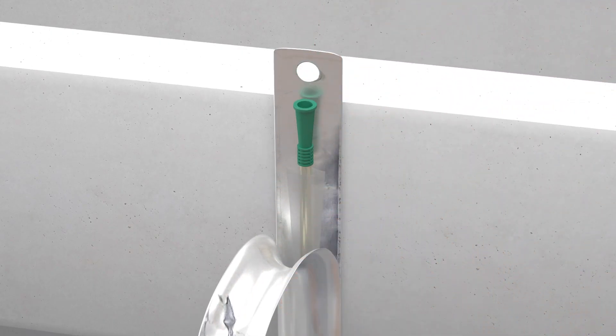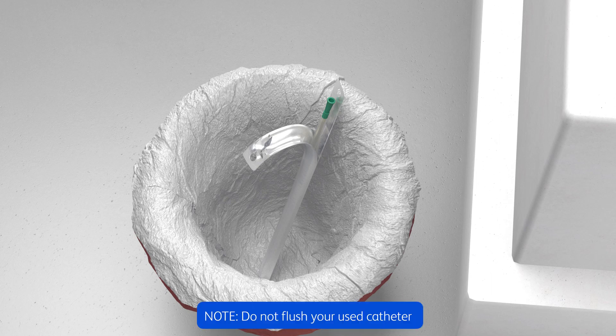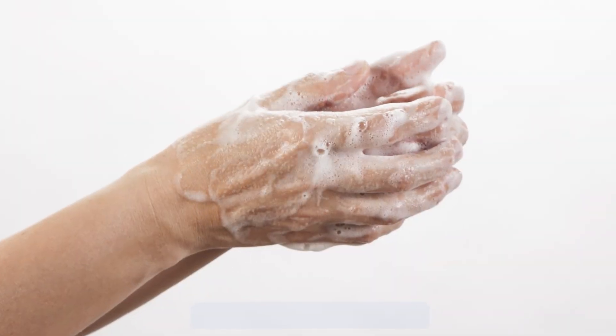Remember, your catheter is intended for one-time use only. After using each time, it needs to be discarded. Do not flush your used catheter down the toilet as it may cause blockage. Wash hands thoroughly with soap and water.